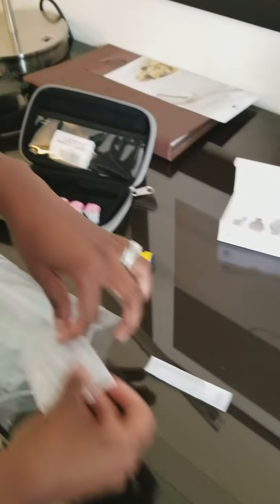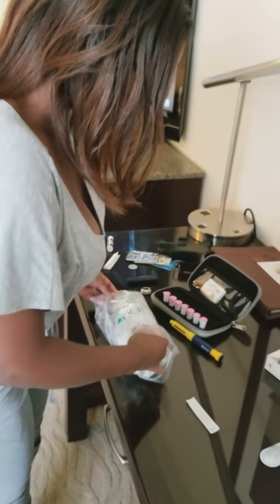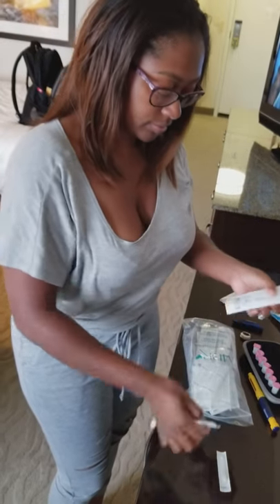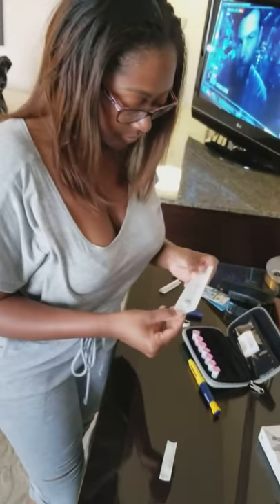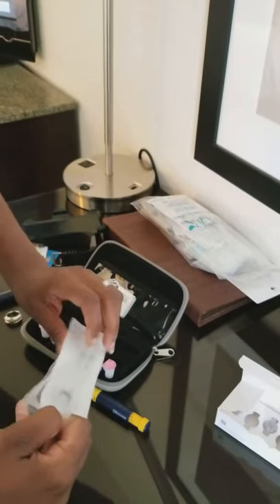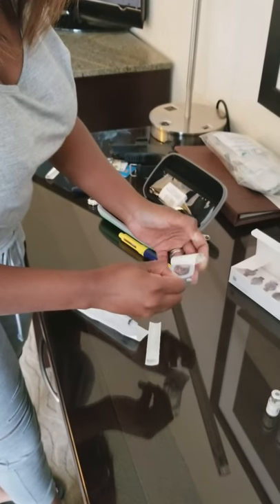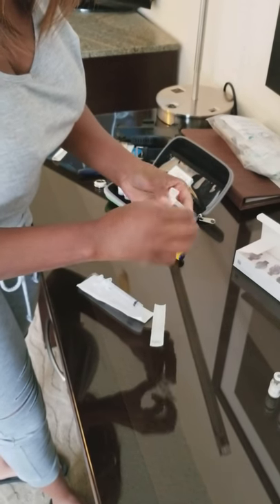This is just me preparing because we want to make sure Chase has the right dose at the right time and we're using the right equipment each time. We take out our syringe — we've already washed our hands — and take out the Q-cap.